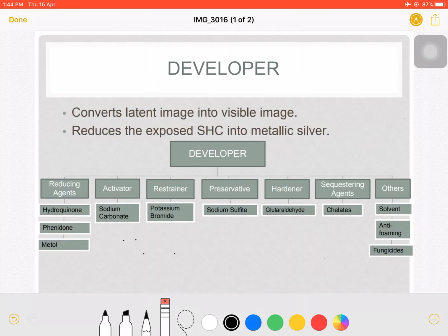For the mixing paddle, based on FDA recommendation, the material should usually be PVC to avoid reaction with our chemicals. And also, a hose should not be used. The hose we use for watering plants, because its pressure is strong. When the pressure is strong, there's a tendency for bubble formation.